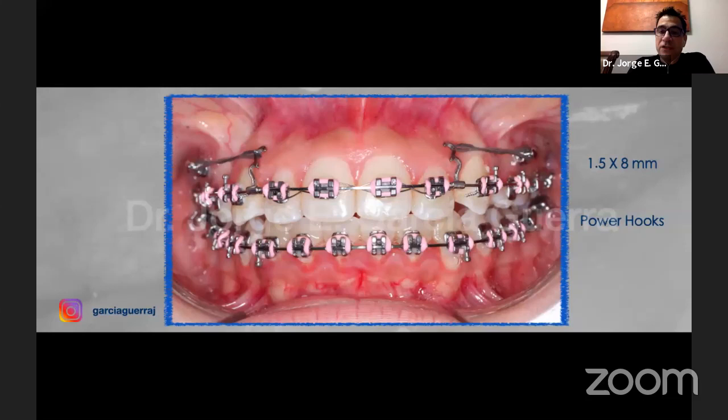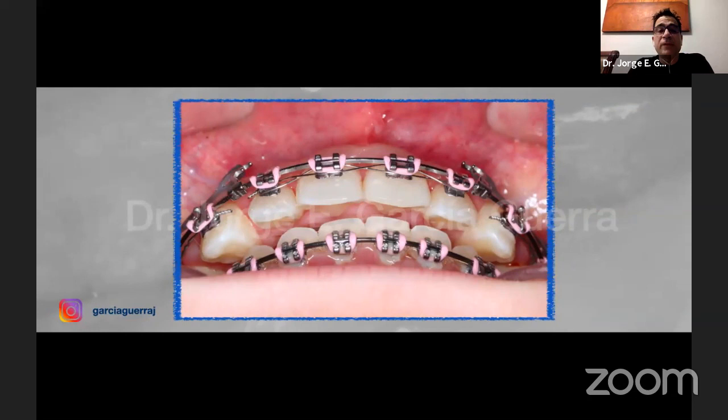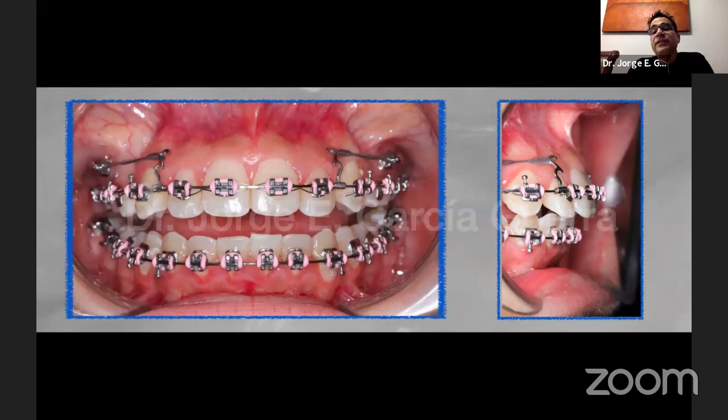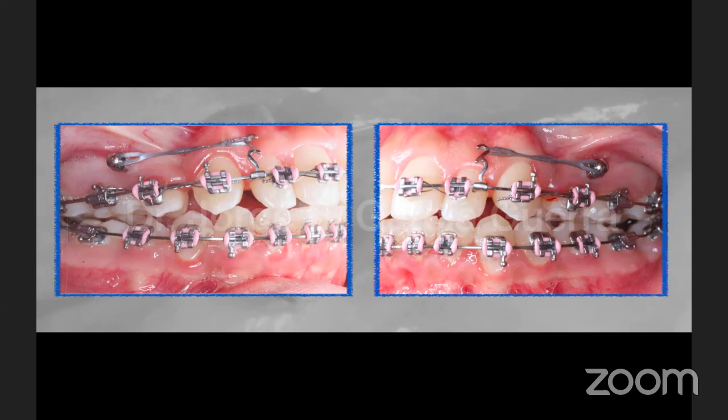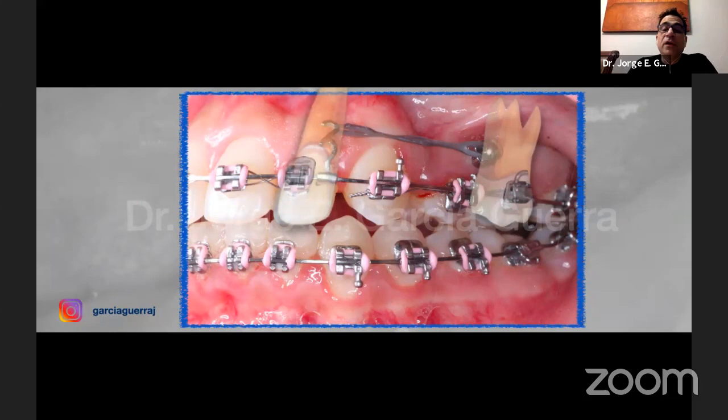You can see here that we still have a little bit of overjet in this case. And we have some protrusion, but I didn't want this incisal position to get overcorrected. That's why we put the mini implants. Now you can see them on the lateral picture. And in this case, so to understand a little bit what we're trying to do here, if you can imagine the roots of the teeth of the molar and the incisors, we're gonna have the center of resistance, okay? That's basically in the middle of the root.